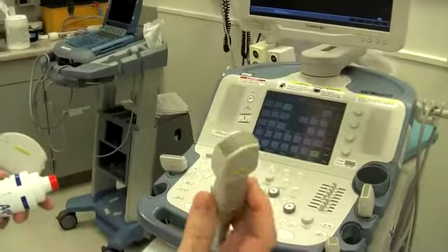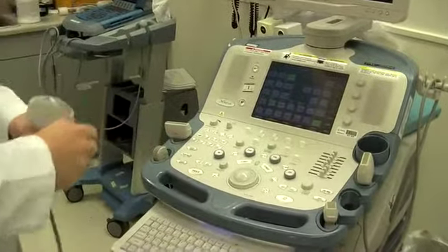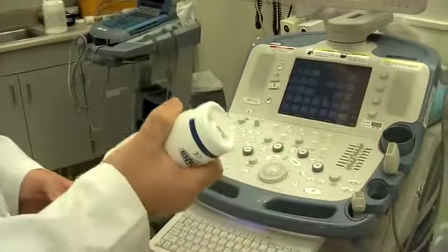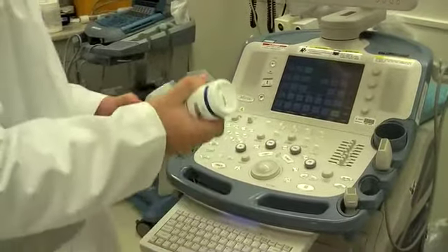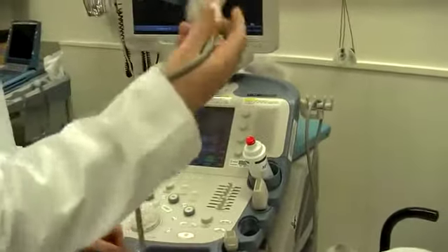For this purpose, I'm going to use the C60 probe. I'm going to get the gel in there. Make sure your probe is clean from prior scans. Gel them up, and we're going to start. Make sure the indicator is in the upper left-hand corner of the screen. The patient's information is in. We've got the indicator.